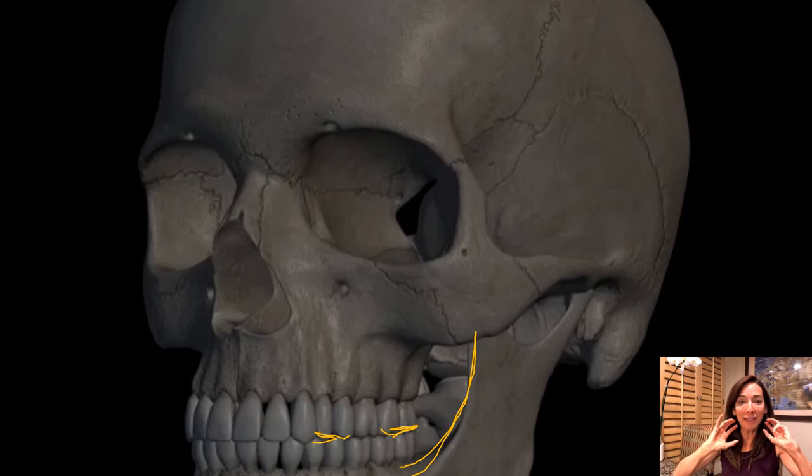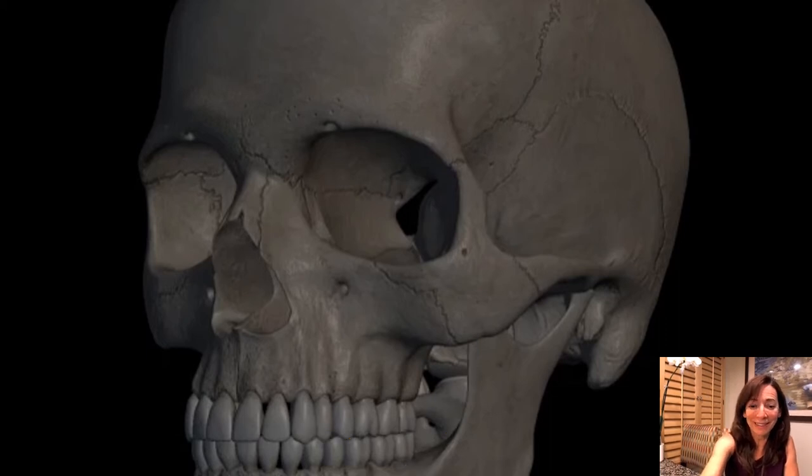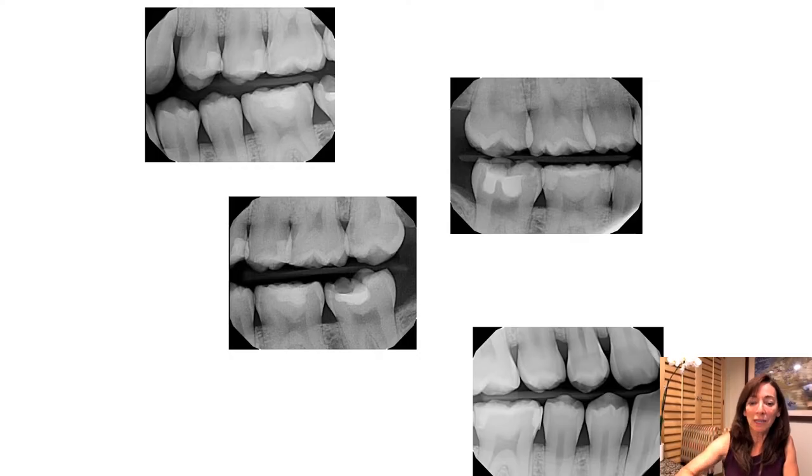Sometimes you'll see that anatomy on the x-ray as kind of a clue. So here are four radiographs — let's take a peek at them and see what we can learn from them.